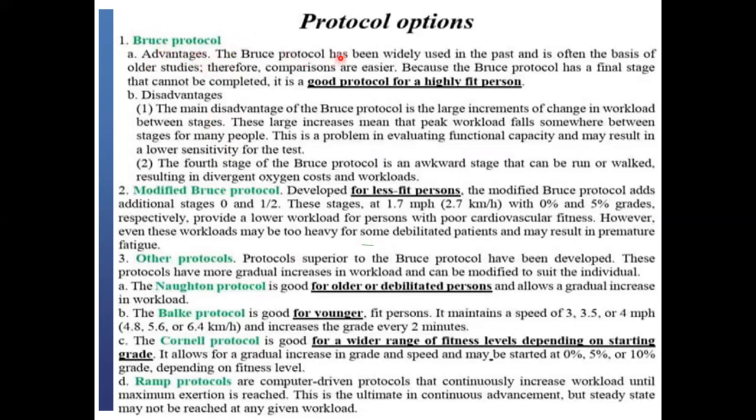The advantages include that it has been widely used in the past and is most validated on the basis of older studies. Therefore, comparisons are easier. And because the Bruce protocol has a final stage that cannot be completed, it is actually a good protocol for highly fit persons, even elite athletes. I think it is the Bruce protocol that they mostly use in their regular assessment of fitness.